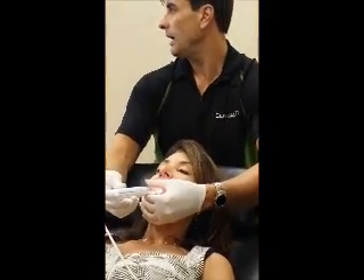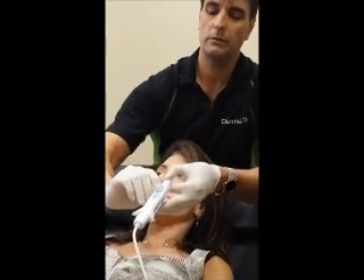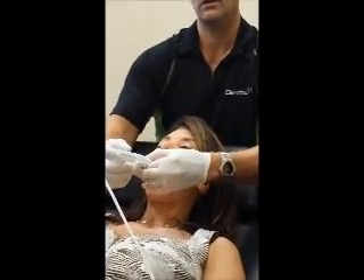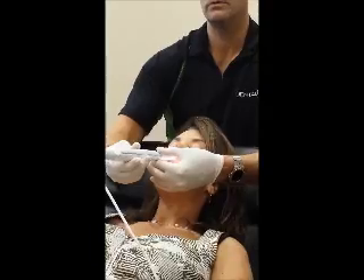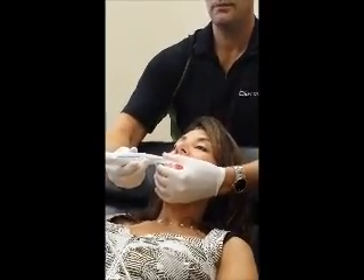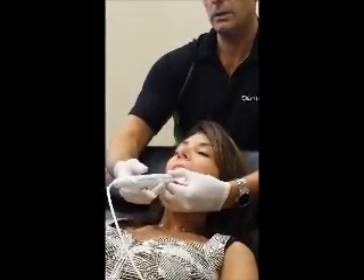I would recommend, if you have air, always drying the mouth off prior to taking these types of shots — it makes it much easier. The next light is the one-tooth view, and that's right in the middle. So if I want to get closer, I simply push down, and that's going to take me closer to the tooth. When you're on a two-to-three tooth view, you're typically on the opposing arch. If I'm on a one-tooth view and I want to look at teeth on the lower arch, notice here I'm fulcruming on the lateral.